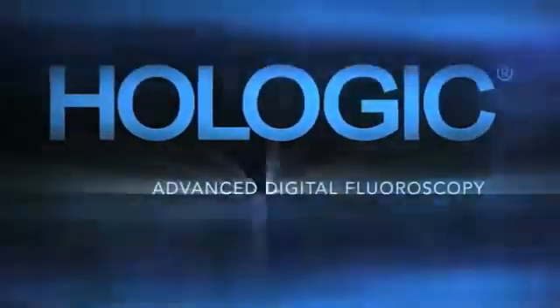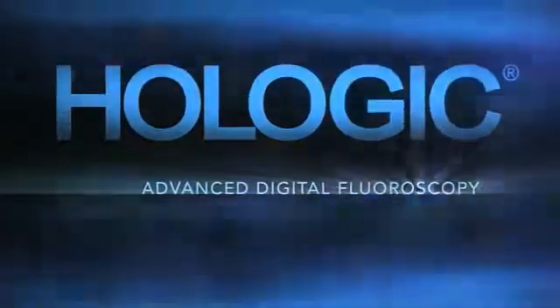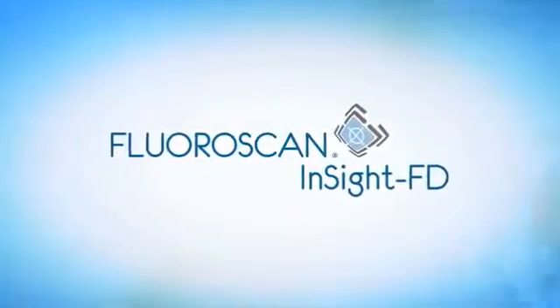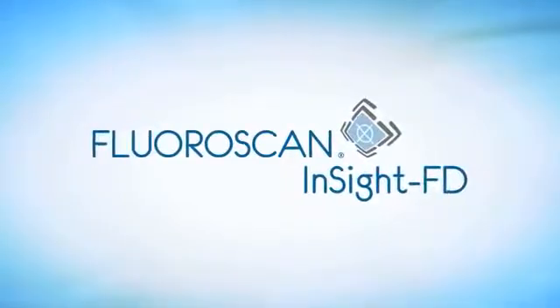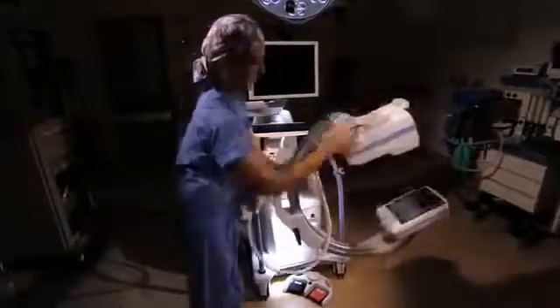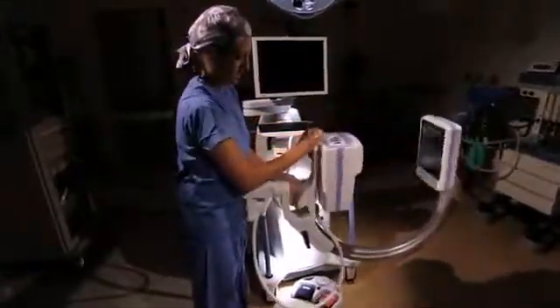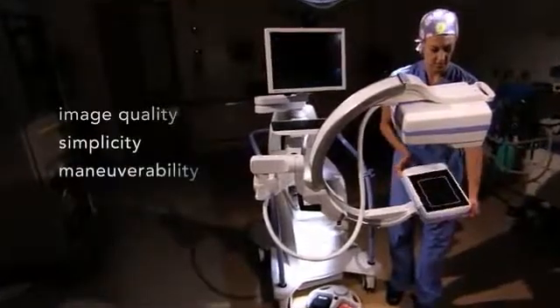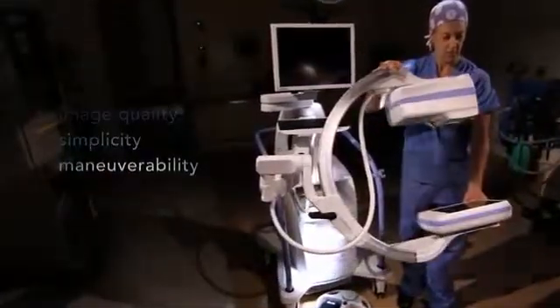Once again, Hologic is redefining digital fluoroscopy with a new mini C-arm called Fluoroscan Insight FD. Fluoroscan Insight FD includes several notable improvements over its predecessors in image quality, simple touchscreen operations, and maneuverability.